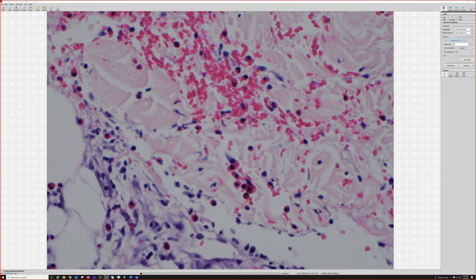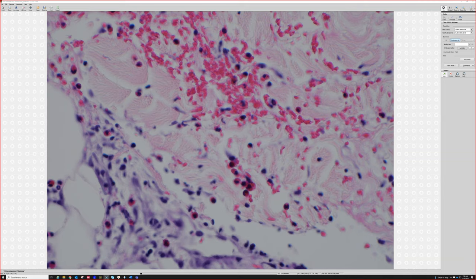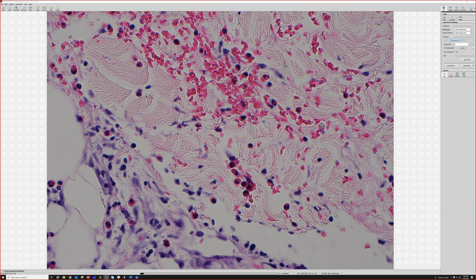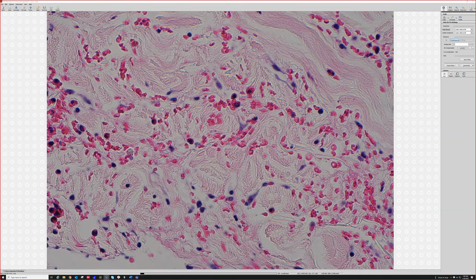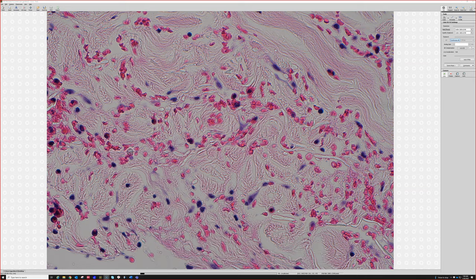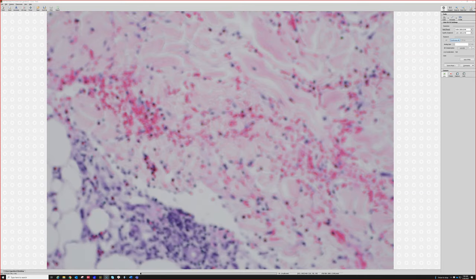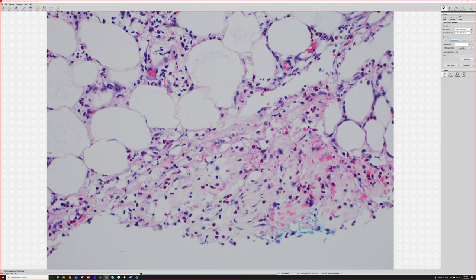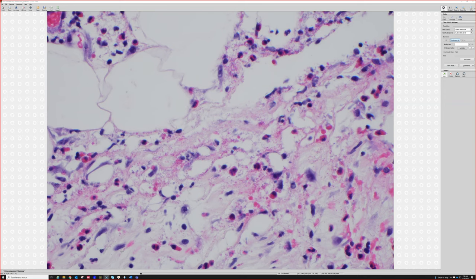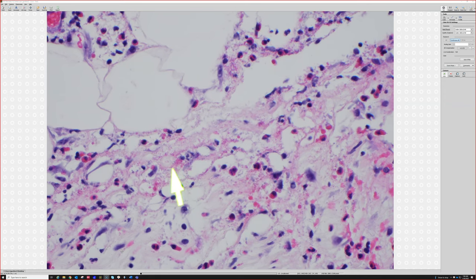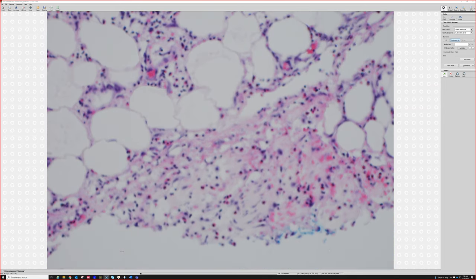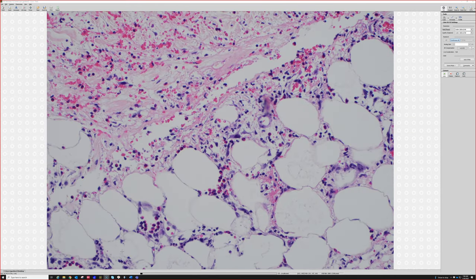The way to find them is when you go to higher power and you see the EOs there, especially if you flip your condenser. Erythrocytes — red blood cells — are smooth, and eosinophils have little granules in their cytoplasm. You can see on a light microscope that there are little tiny granules in the eosinophil cytoplasm. And here, look — the granules are degranulating, spilling all the eosinophil granules. Eventually they'll start to coat the collagen fibers, and when they get really thick and the collagen starts degenerating, it makes a little structure called a flame figure.